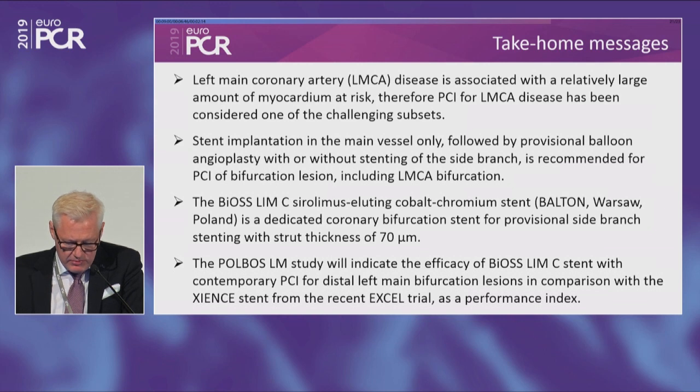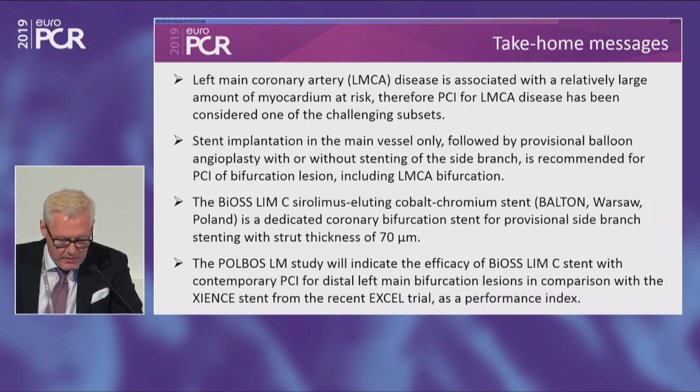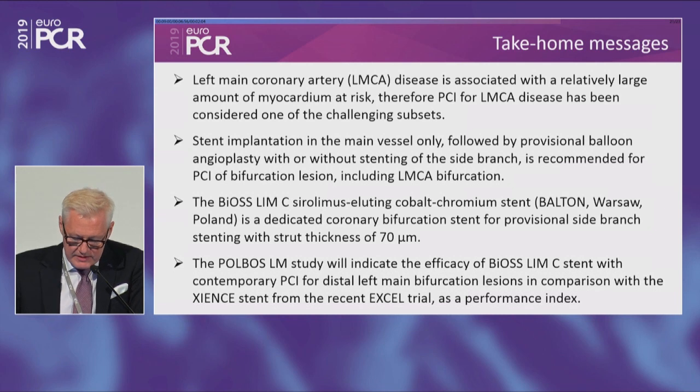And finally, the POLBOS Left Main study will indicate the efficacy of BiOSS Lim C stent with contemporary PCI for distal left main bifurcation lesions in comparison with the Xience stent from the recent EXCEL trial as a performance index.